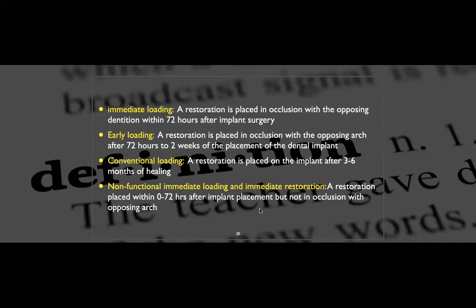And we're going to discuss why we do that on single cases. If you have multiple implants, you're a little bit safer, because the implants can share their loads, so they can be splinted together. Versus when it's a single case, it's much, much harder for an implant, or you'll be asking too much on these cases.